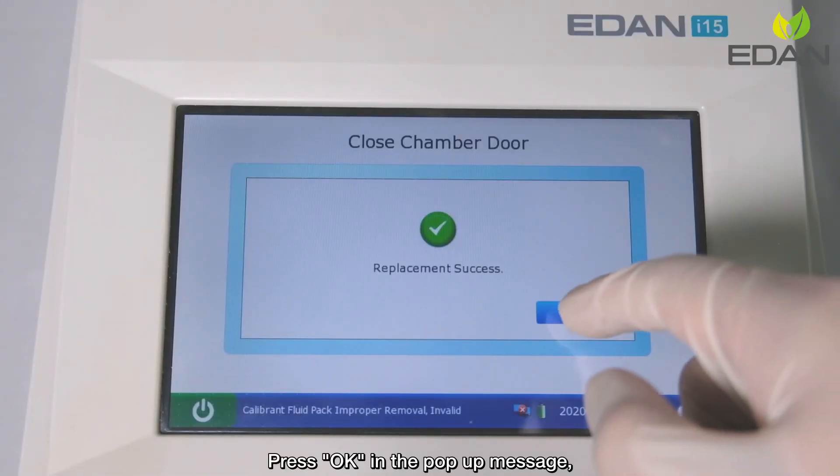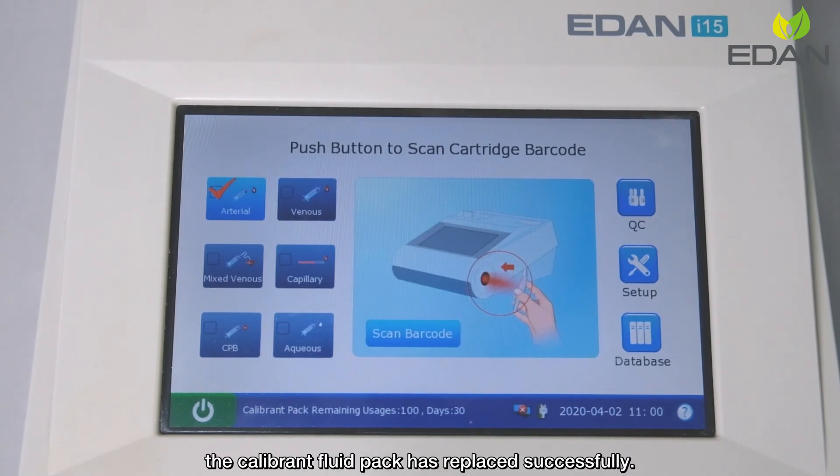Press OK in the pop-up message. The Calibrant Fluid Pack has been replaced successfully.